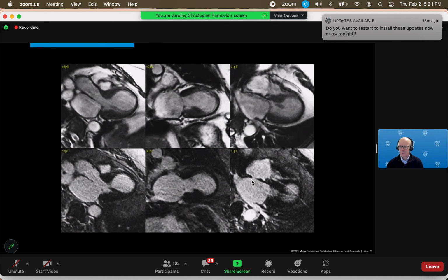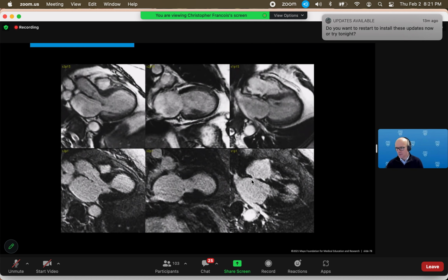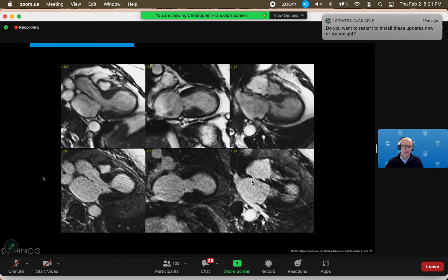And so the key to differentiating this from coronary artery disease is to look at the coronary arteries. Because these patients frequently have some mild troponin elevations and non-specific ECG changes, most of them go to the cath lab and they show clean coronaries, and then we do the cardiac MRI to see if this is, in fact, stress-induced cardiomyopathy or some other non-ischemic cardiomyopathy.